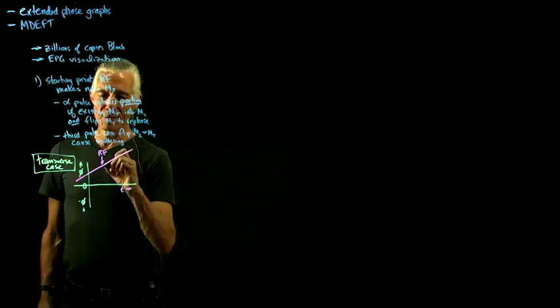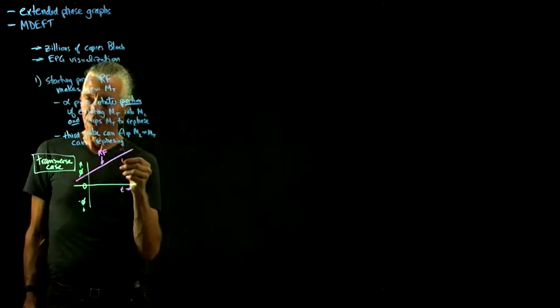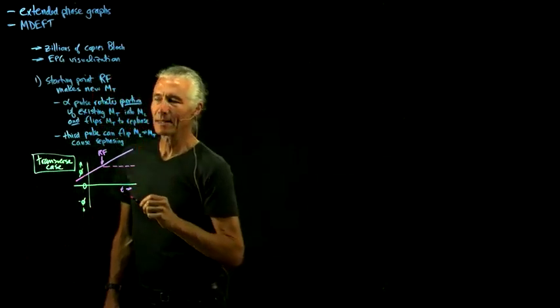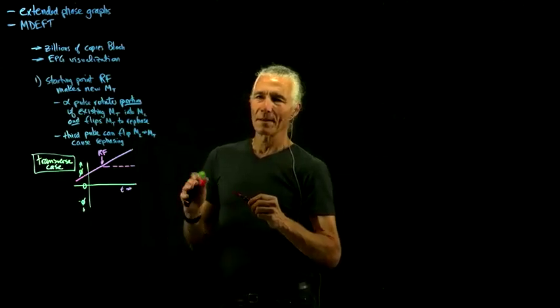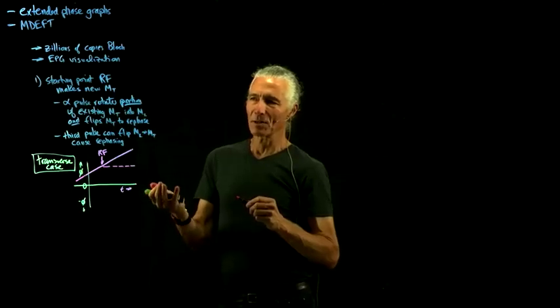So we leave some of the transverse magnetization continuing to dephase, and then we put dashes for magnetization that we turned into longitudinal, which is no longer affected by the B0 field. So it doesn't change its phase.